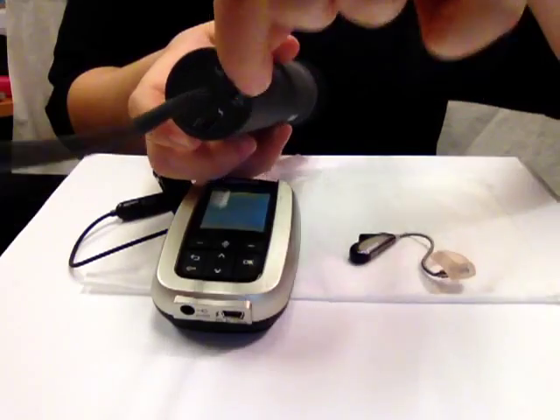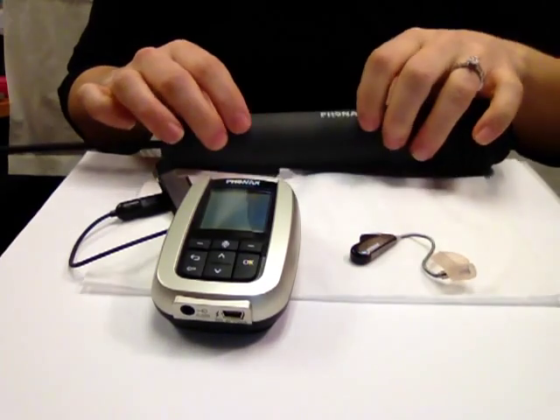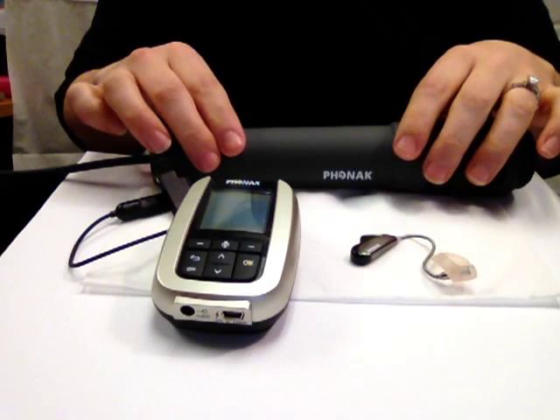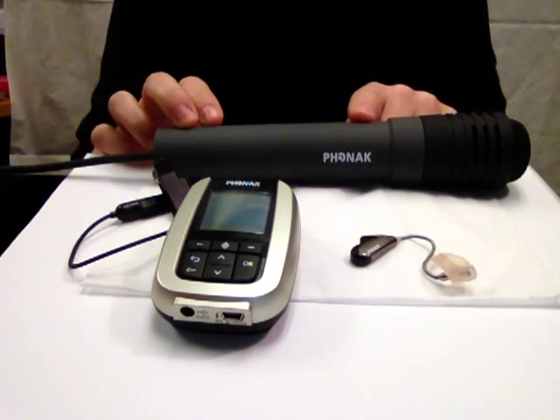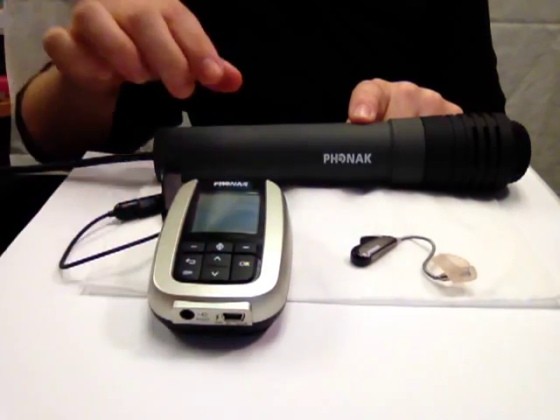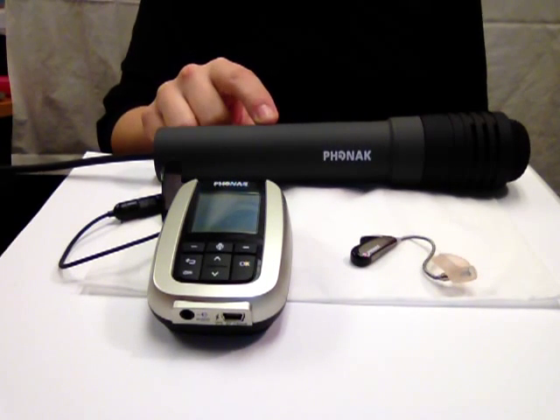The DynaMic must be turned on during the audio pairing time window of 8 seconds. The DynaMic joins the multi-talker network as a secondary transmitter. It starts working as a transmitter through the Inspiro network. After the initiation is complete, the name DynaMic appears on the Inspiro's LED screen. Press OK. Please note the multi-talker network setting is stored in the Inspiro transmitter.